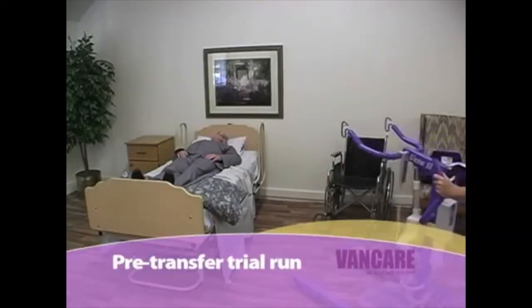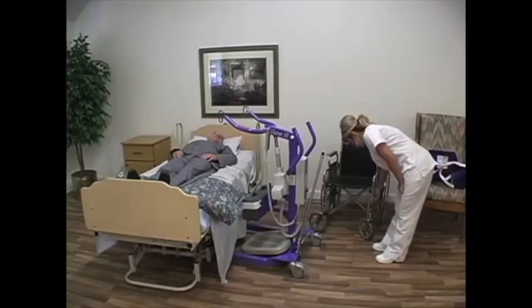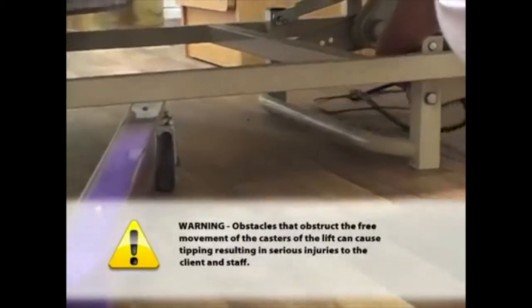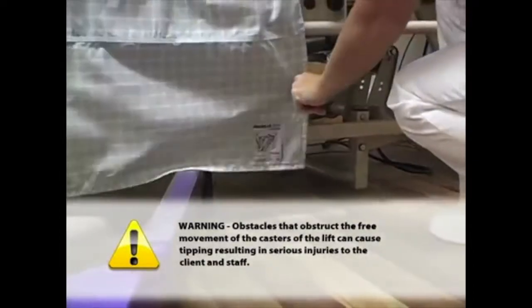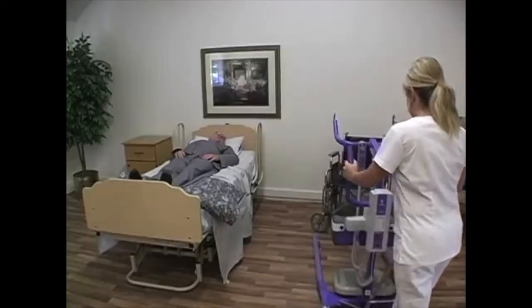Pre-transfer trial run. The purpose of the trial run is to prepare the destination surface for the client and to look for obstacles to the transfer. Warning: Obstacles that obstruct the free movement of the casters of the lift can cause tipping resulting in serious injuries to the client and staff. Also you will determine the best path of travel for the transfer.